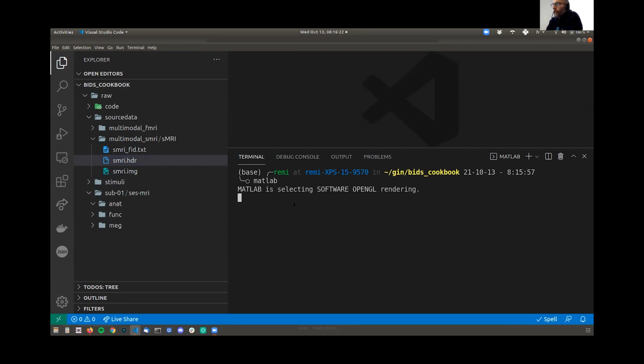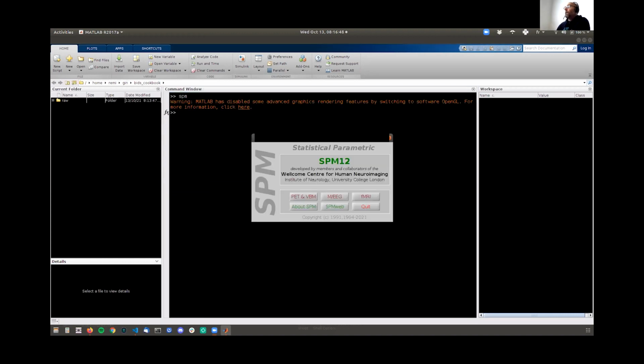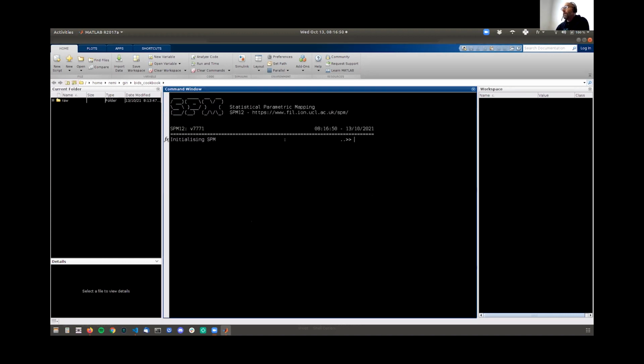And then we're going to do it with SPM. But this is also to show you what you would have to do if you had DICOM data. You would have to convert your DICOM data into this NIfTI format. So this is a bit similar to what you would have to do anyway. SPM also has functionalities to do that conversion from DICOM to NIfTI. Here, I'm just going to be doing something a bit different.